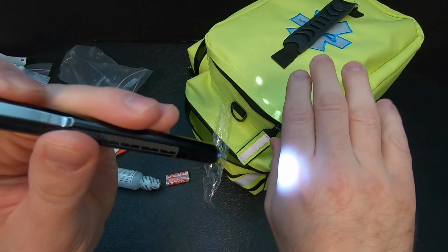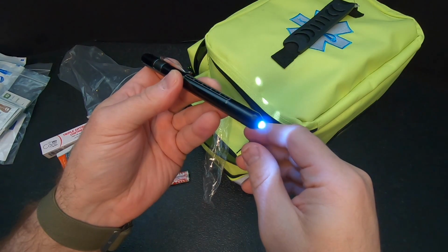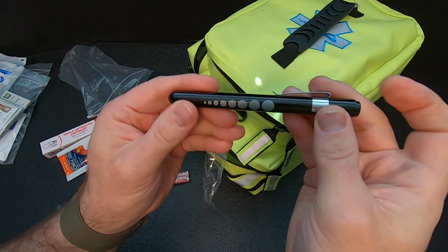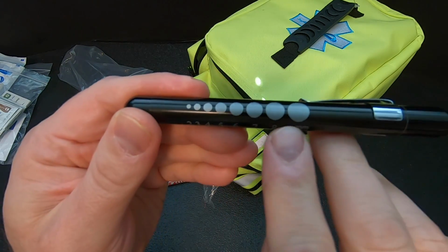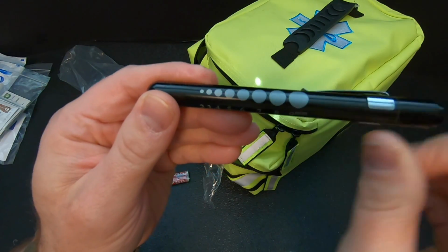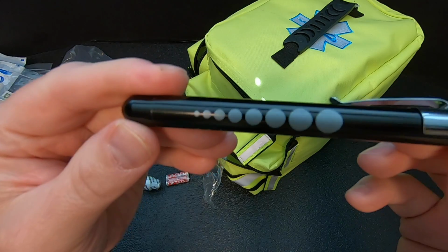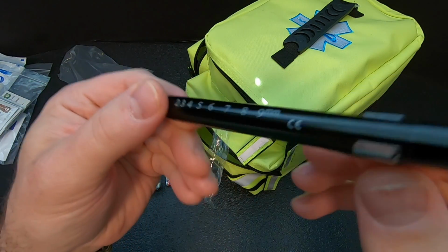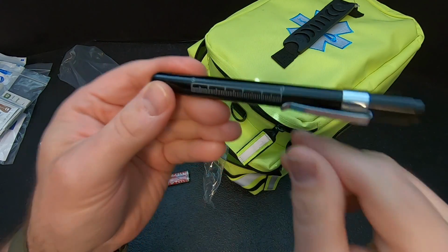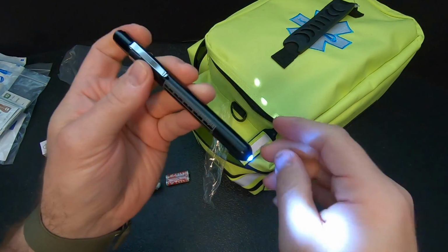And they're not terribly bright, but they're perfect for quick medical examinations, in particular, looking in the ear, nose, throat, and eyes. And so these dots here, I think those are to help you judge how dilated someone's pupils are. That's what I think those are in millimeters. If I'm wrong, someone please say so, but that's my hunch. And then we've also got a little ruler on the back in centimeters and millimeters. So pretty handy, just for looking down someone's throat, in their ears, and their nose, and their eyes.